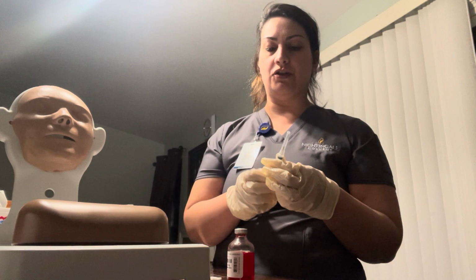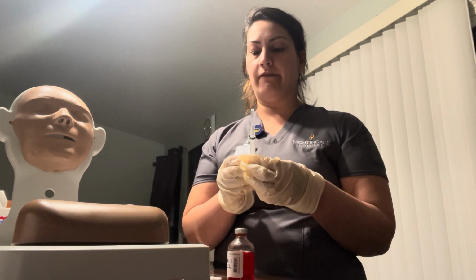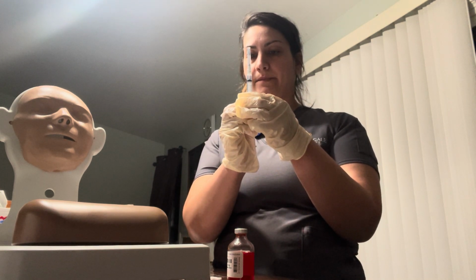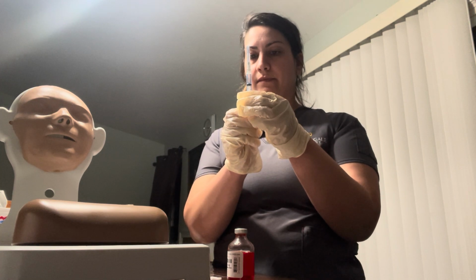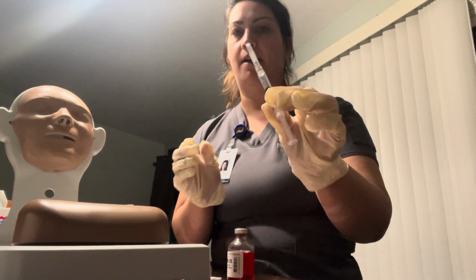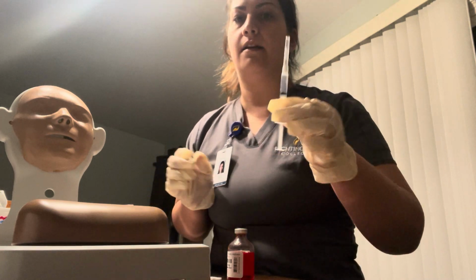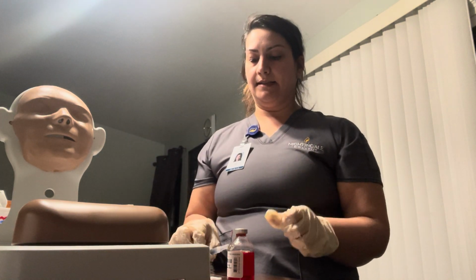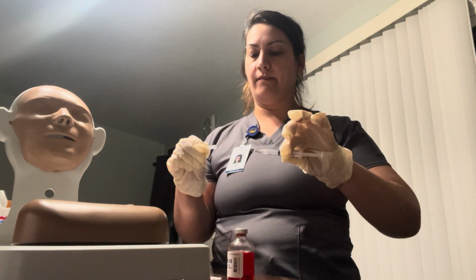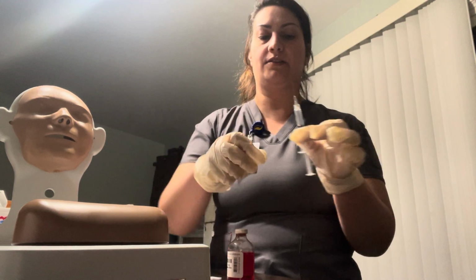Next, I'm going to put in my air, 1.5 mLs. I will hold it like a pencil, up. So 1.5 mLs. You guys can see that. Okay, perfect. Next, I'm going to take my 2 fingers here. I'm going to take off the cap. We'll use this next for the 1 scoop method.